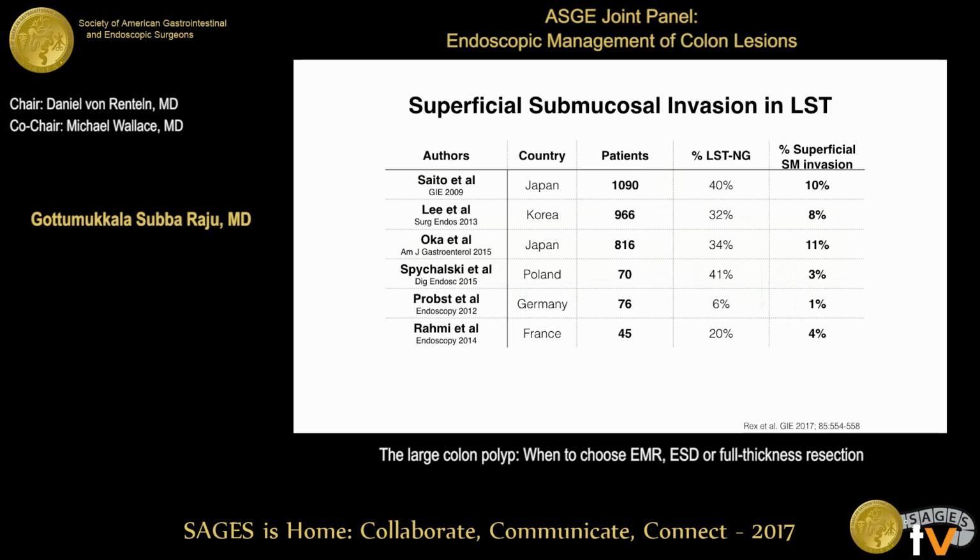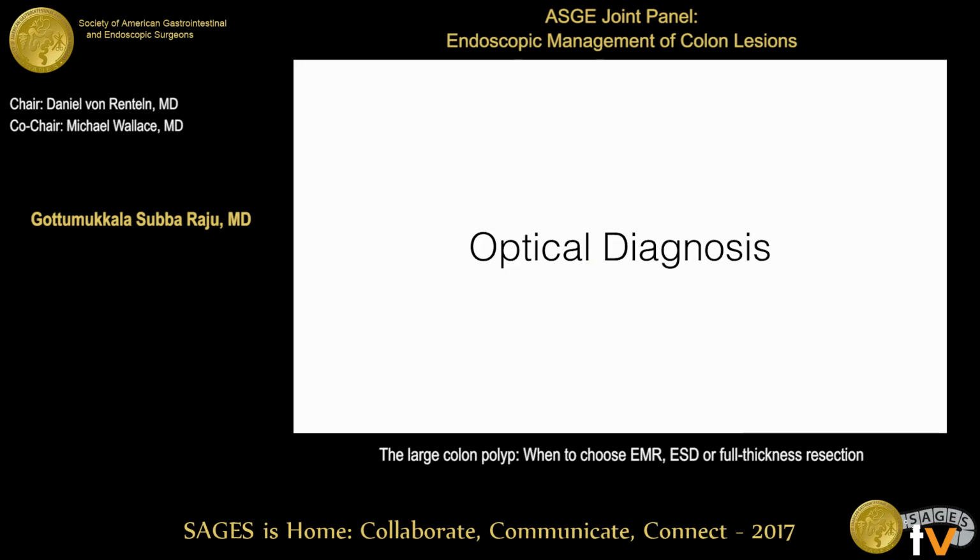So for those 10% which have submucosal involvement, if you end up doing a piecemeal resection, you could still say maybe that 10% could have a surgery. So something to keep in mind in terms of the risk of superficial submucosal involvement in laterally spreading tumors. Amit has covered this in great detail.